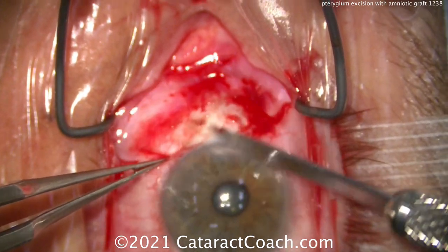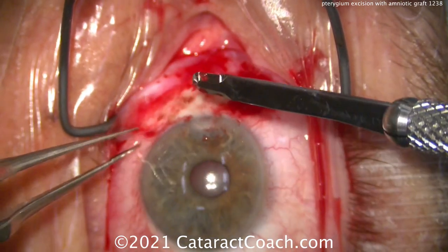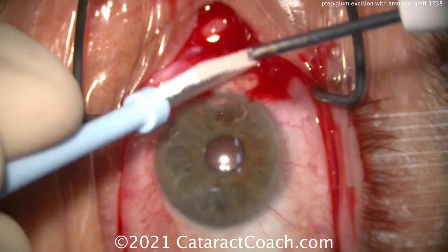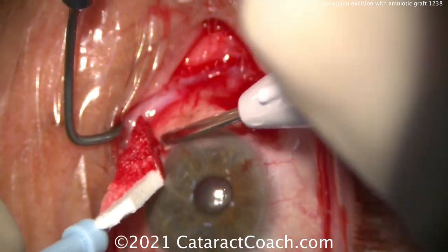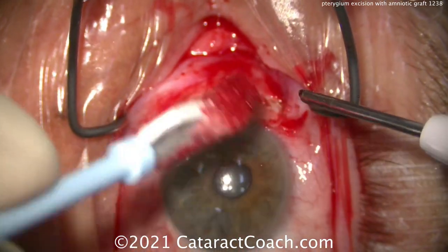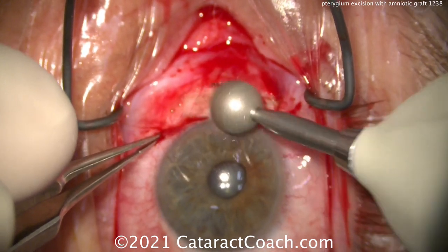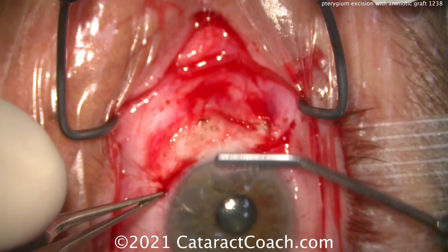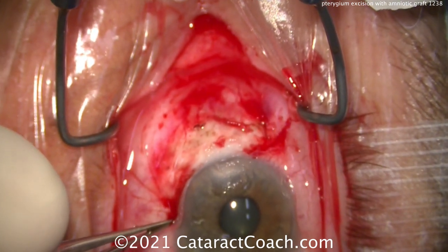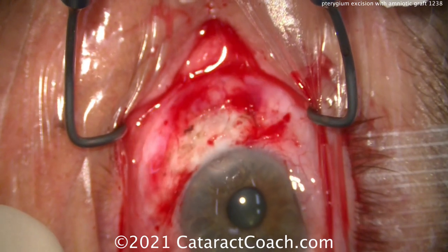Remember — it's that little white haze in the cornea. Don't think that you're just going to keep burring until all that white haze is gone, because that stromal haze may be deeper in the cornea than you think, and you don't want to damage the tissues here. So now we're scraping it down to sclera — I want a nice clean bed there, I don't want any remaining bits of material. Here's that burr, and again, less is better — just a little tiny bit of burring. My goal is to have it smooth; my goal is not to remove the white haze. You can pinch here with the 0.12s to see if there's any little material left — that looks pretty darn good.